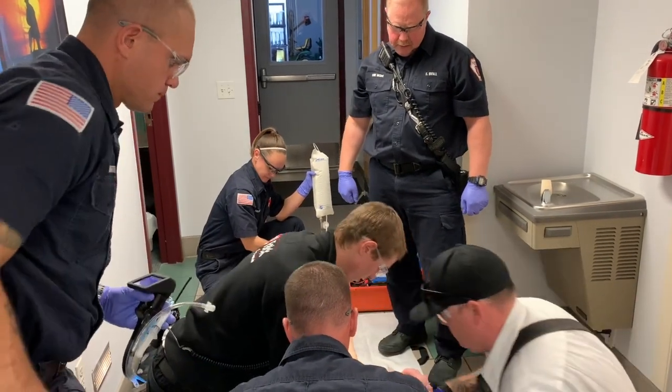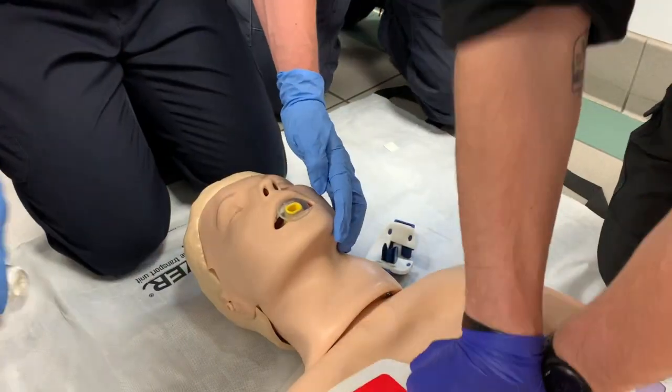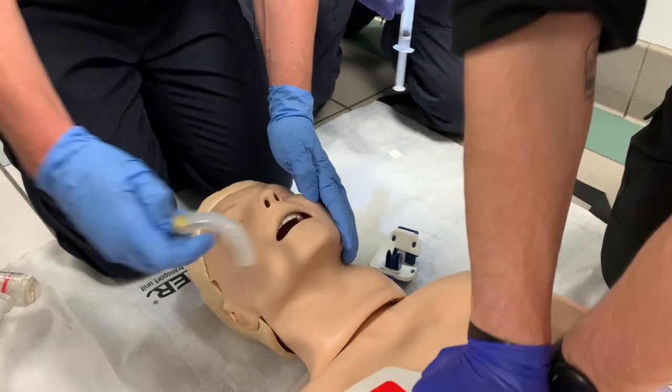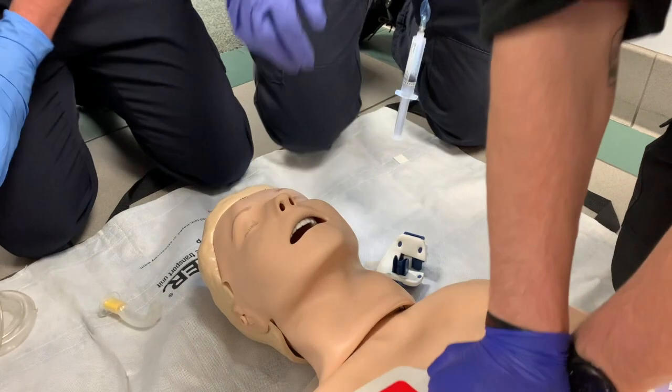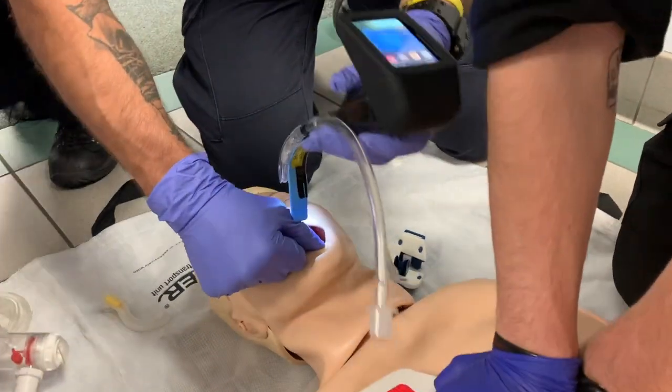Mike, let's go ahead and pull the mask and pull the OPA out. Mike, if you want to step back. Okay, your airway looks clear. Ben, if you want to set that bag valve mask up.